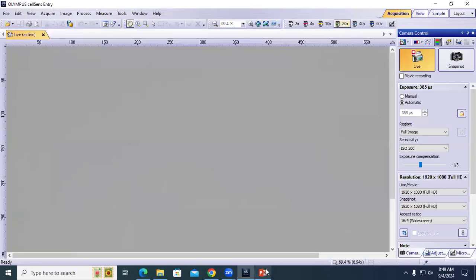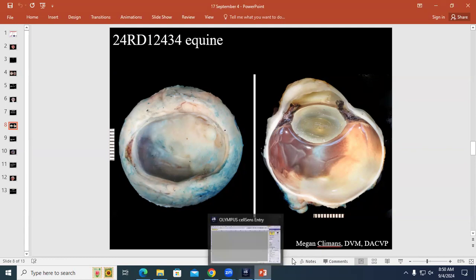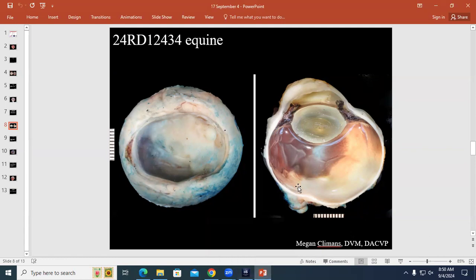Let's go back to the gross. Dr. D saying there was only a tiny tapetum in the gross image. Yeah, it may be that it's just kind of a weird section. Okay. But I mean, there's a corpora nigra on one side and not on the other, and it's supposed to be a DV section. So. Cool. Yeah. Mini tapetum there on top. Yeah. Oh yeah, right there.